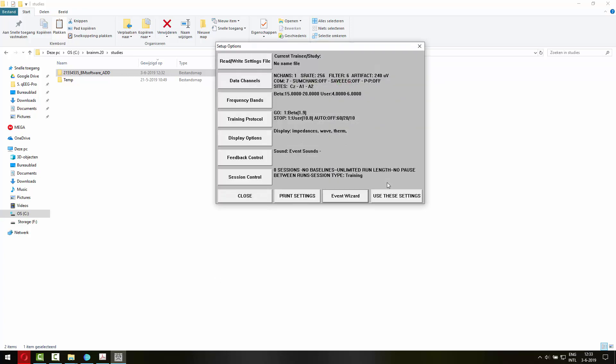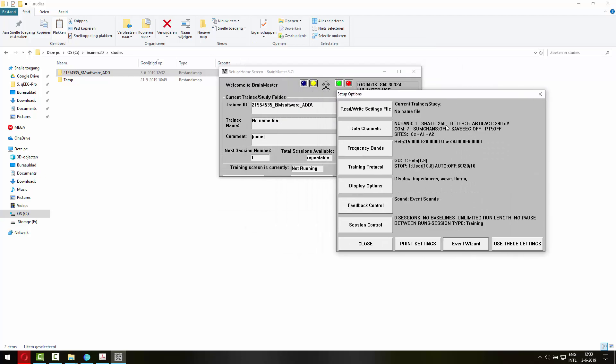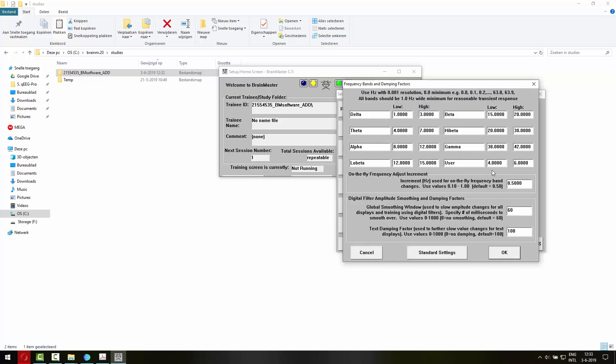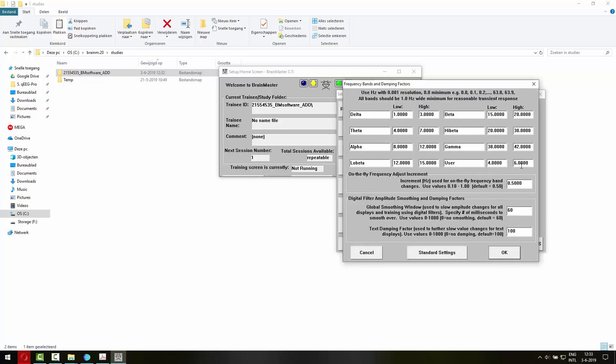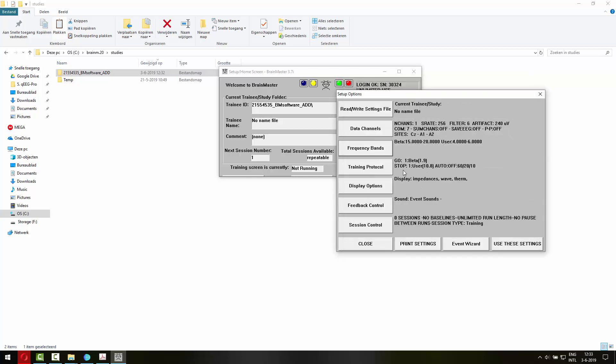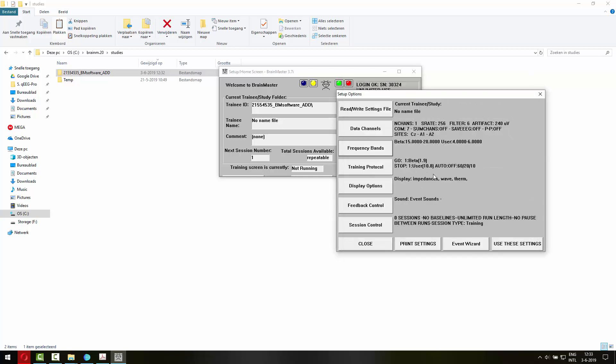So let's look at the settings. As you can see, the channel information is correct. So CZ was recommended to train with a go on beta and a stop on the user frequency. And the user here is defined as 4 to 6 Hertz. So 4 to 6 Hertz is trained down while beta is trained up.